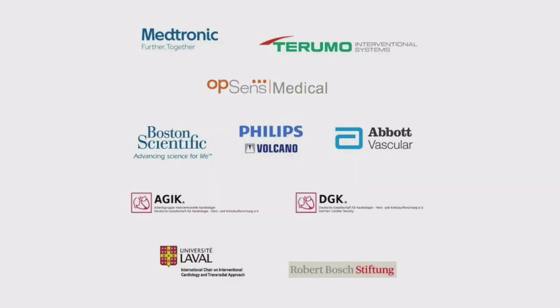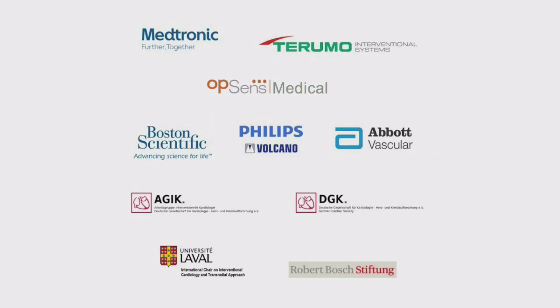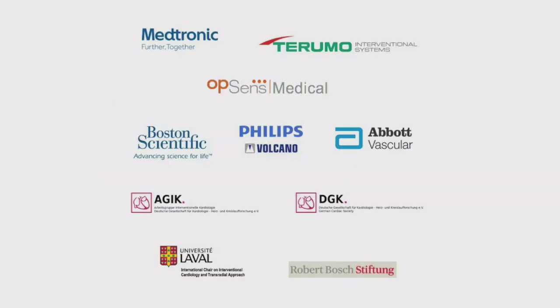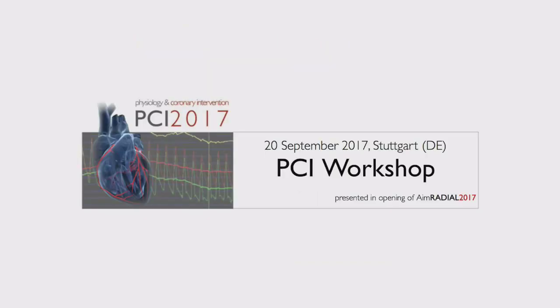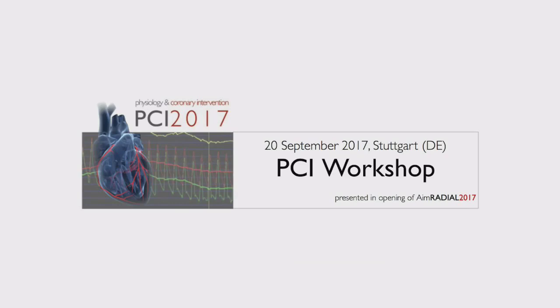So clinically, we need to prove that what we are doing is good for the patient. But in the meantime, I think registries are very nice to develop. So I would also encourage everybody to take these measurements and to check their own results. What I can remember is a case that I did for diagonal stenting, and it was very positive. It was an FFR of 0.33. I stented it and arrived at 0.68. And in the very end, I realized that I was missing the ostial left main, which was causing all the drift. So this is why I keep measuring post-PCI FFR every time I can, because of this kind of complication or this kind of caveat.